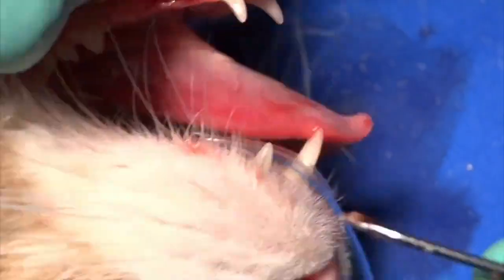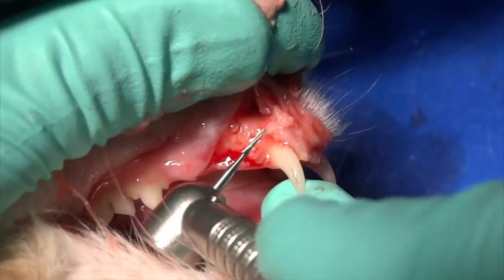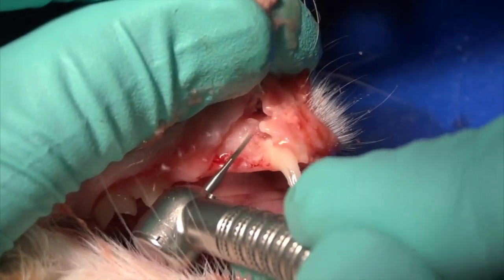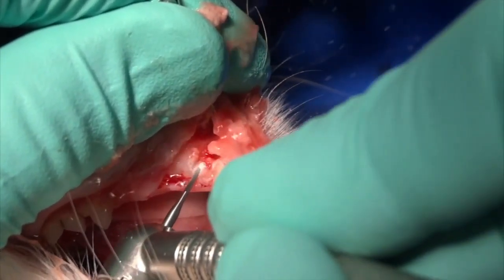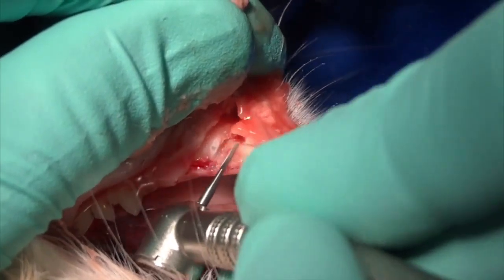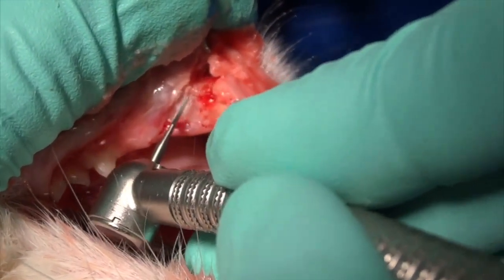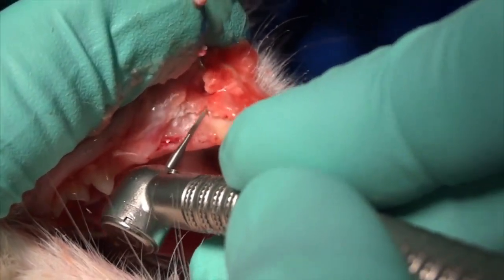You can see that tooth looks pretty normal at that point. This is partial extraction — I like to refer to it as partial extraction versus crown amputation because we're not really just removing crown; we're removing part of the tooth that is still normal and possibly some granulation tissue. You see how that's bleeding right there — that is bleeding granulation tissue down inside the defect where it's starting to resolve. So we're removing that abnormal tissue in addition to removing the bone to expose the tooth root prior to extracting it.